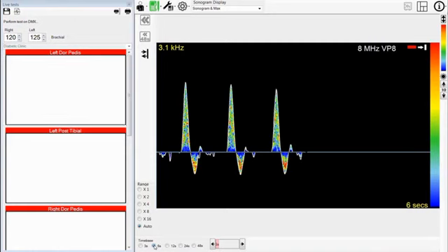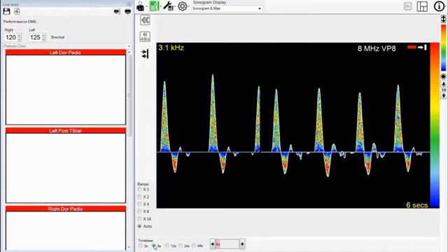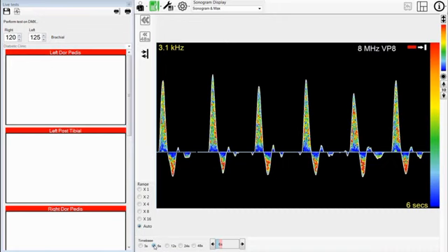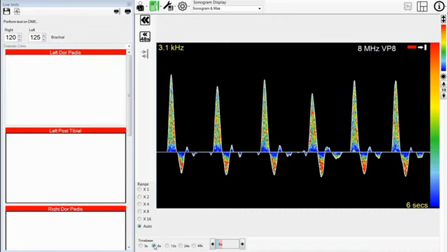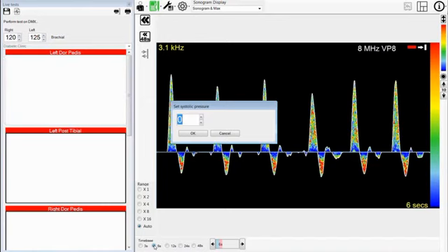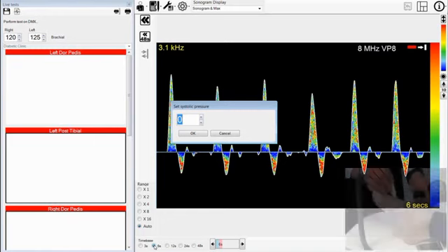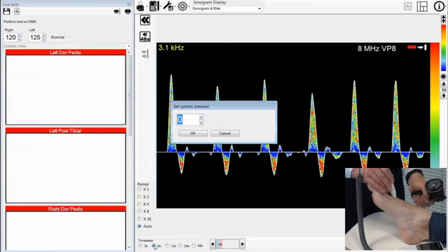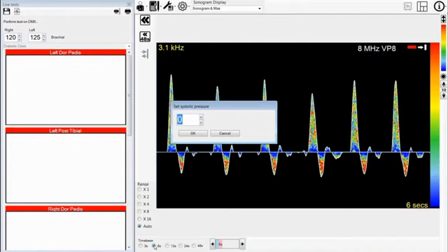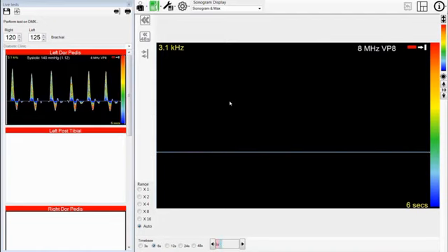Now you can see a nice triphasic waveform. To stop the trace, press the space button on the PC or the stop button on the Doppler. If you want to measure pressures, press the middle button on the Doppler which is the pressure symbol. This will release the Doppler but not delete the waveform. Now you can make the pressure measurement in the normal way with a cuff around the ankle.